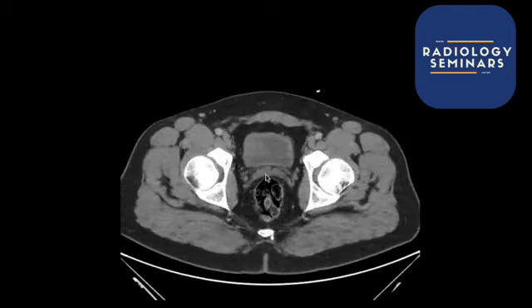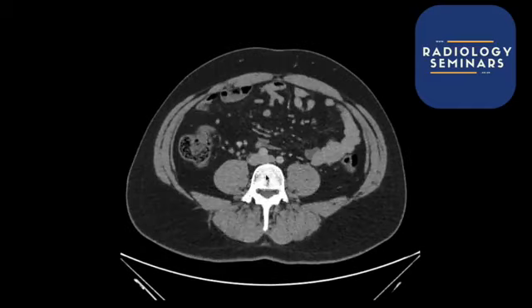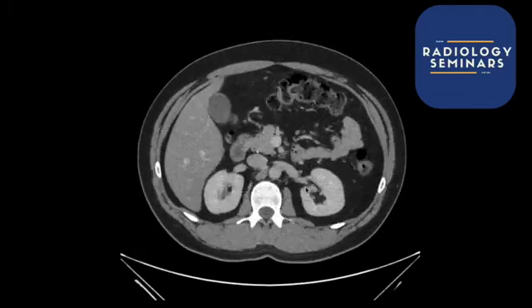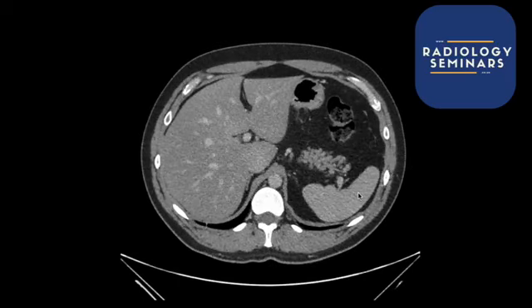So ultrasound is usually a good way to go when you are looking at the urinary bladder. And then one of the other upper abdominal solid visceral organs is going to be the spleen. So the spleen sits over here. Okay, so I've seen a few different ways to measure it.